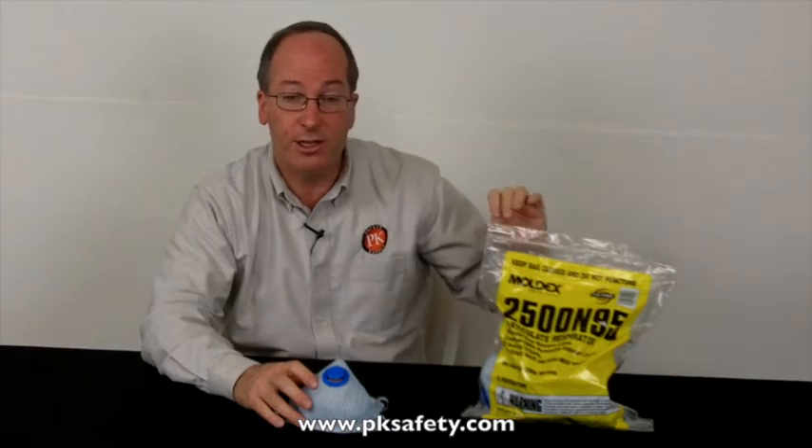These are going to come in a bag of 10. This bag has a Ziploc top, and I suggest you close that when you're not using it, as this is going to keep the mask from absorbing things out of the air.